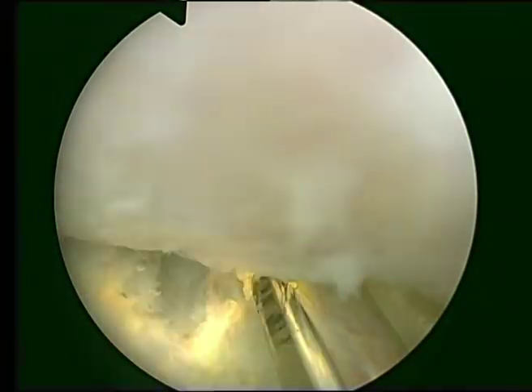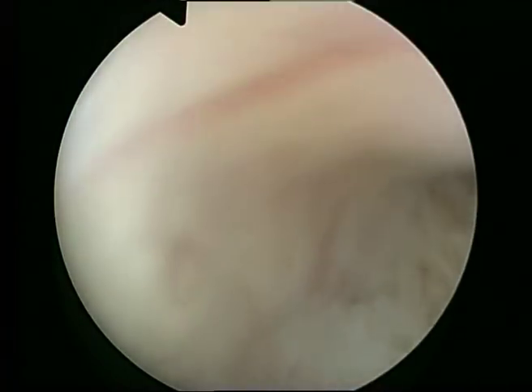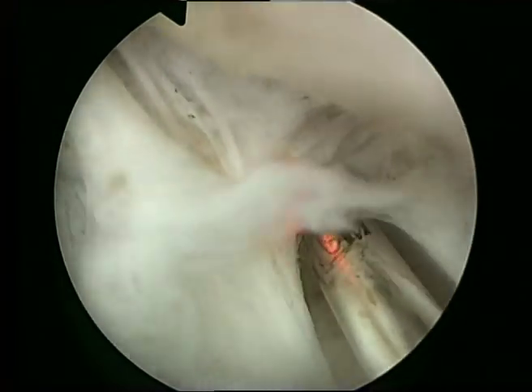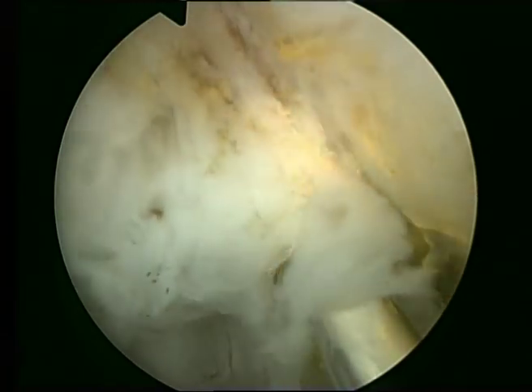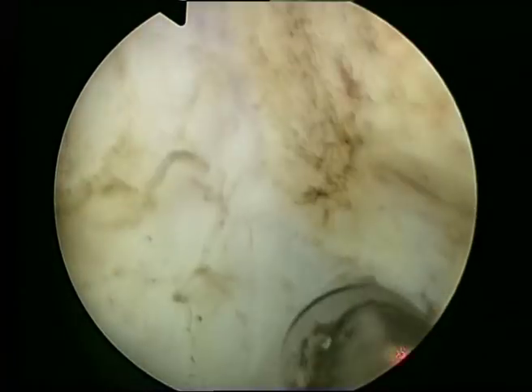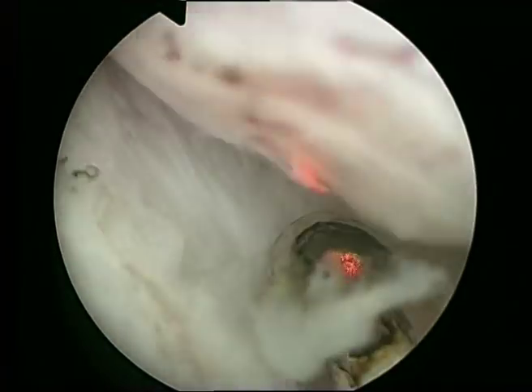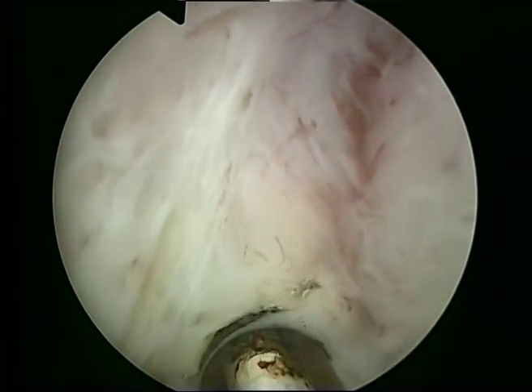There are some fibrous attachments that you will have to cut with the 80-watt power setting to be able to continue detaching the adenoma from the capsule — some fibrous attachments are not easy to release just by exerting pressure with the cystoscope. The tip of the fiber is very useful to find the right plane and to help in the progressive dissection. This is not an operation that can be rushed — you need to be patient and slowly detach the adenoma. With experience, we have been able to cut nucleation times significantly and can enucleate relatively large glands in a very limited amount of time.